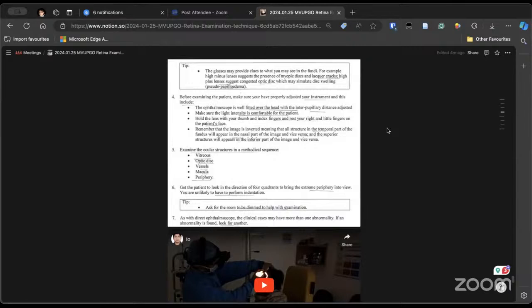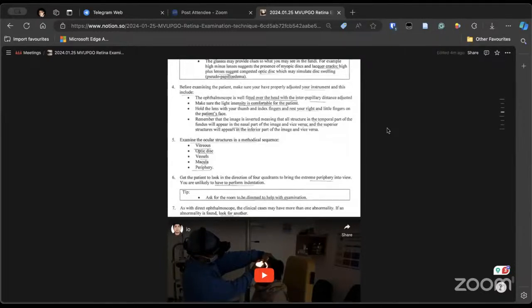So the optic disc we have already discussed. You have to look at the size, shape, margin, color of the neuroretinal rim, the optic disc, and any other abnormality of the neuroretinal rim, and then you look at the vessels. For vessels, you look at the vascular abnormality, and if there is vasculitis, you look at which vessel is involved, vein or artery. And for the macula and periphery, there might be multiple findings.